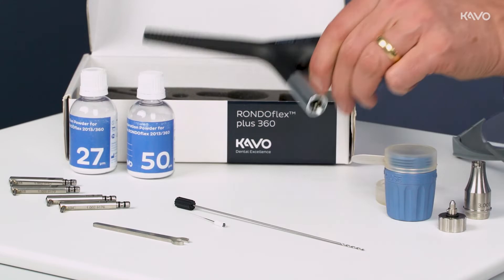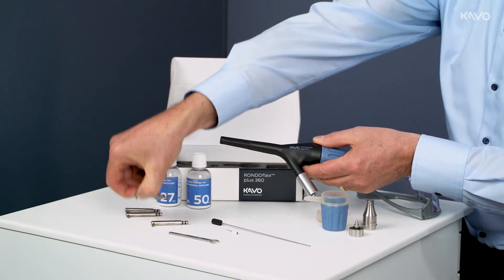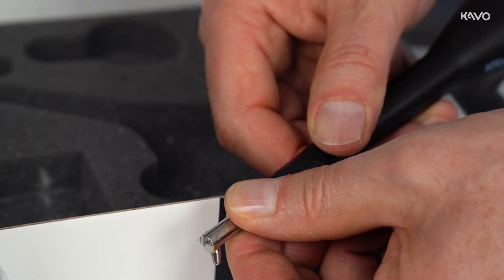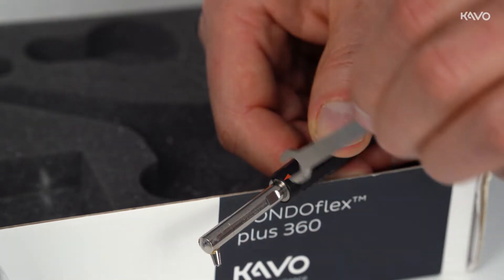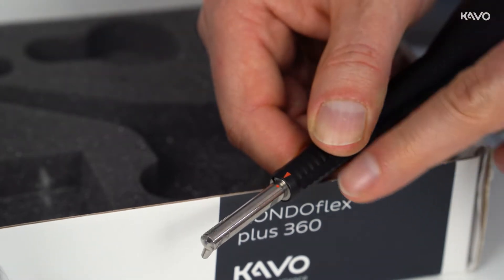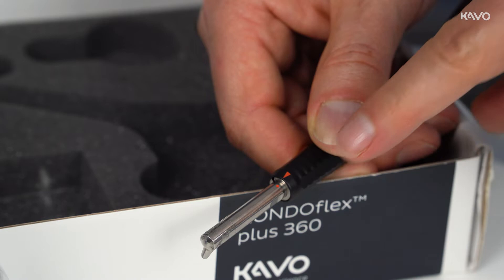Preparing the RONDOFLEX PLUS 360 for treatment is easy. Depending on the indication, the appropriate powder and canular are selected. Once the canular has been attached, it is locked in place with the key. If the red markings are directly above each other, the canular is correctly fitted.